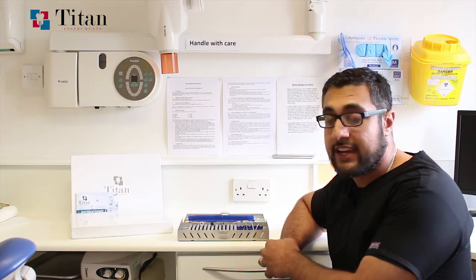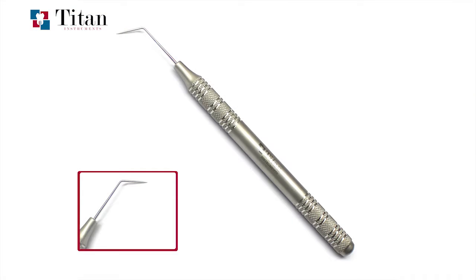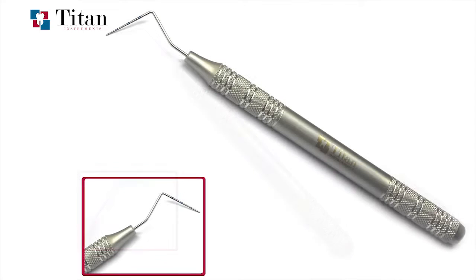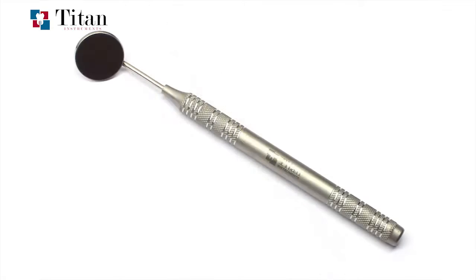Starting on the left hand side, there are three instruments for inspection: a standard Explorer probe, a UNC-15 probe which is graduated per millimeter for marking out implant positions, and a mirror.